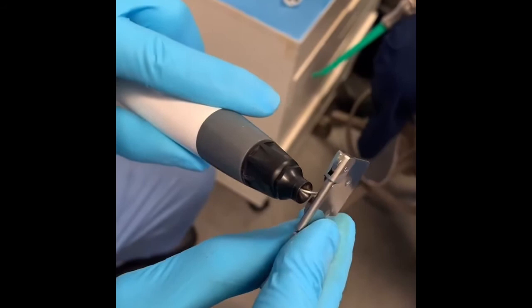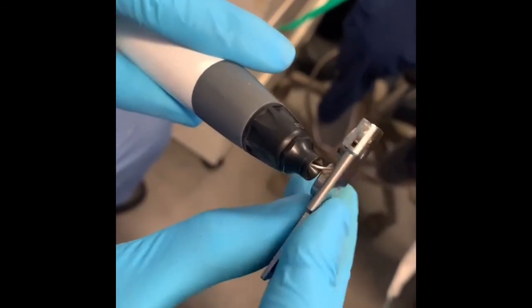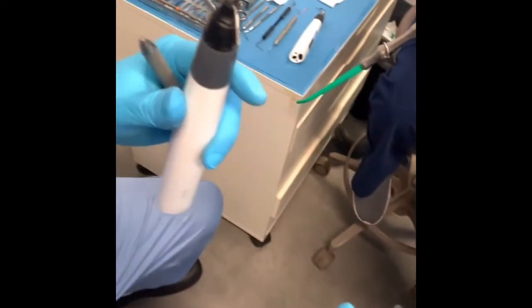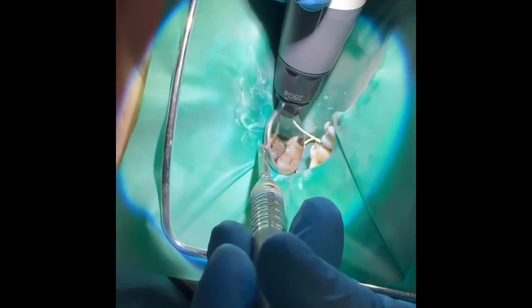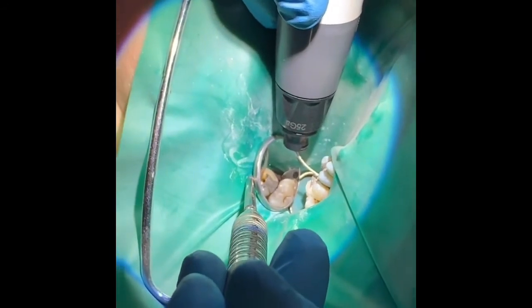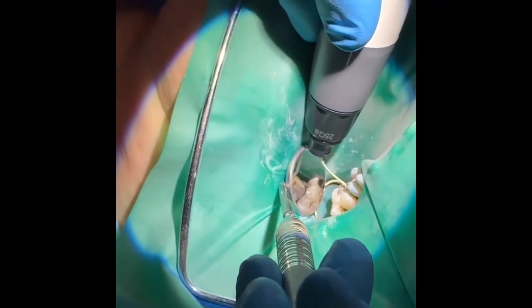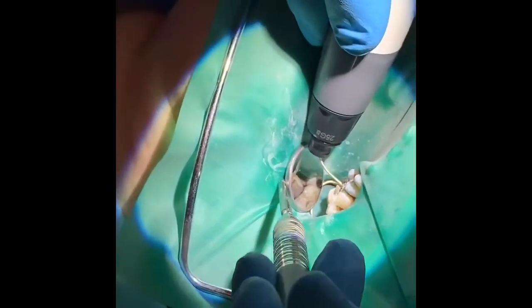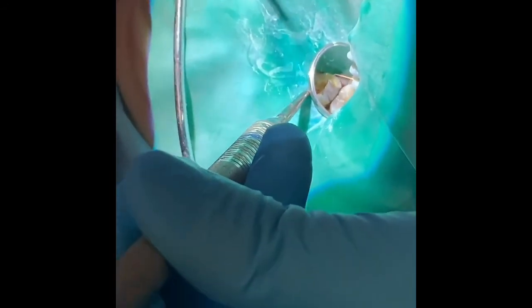Let's bend it, but not break it. There's a button there — you just hold the button down and it extrudes the gutta percha for you into the canal, just like that. I don't know if you can see in my mirror — wipe this for me, hold on, let's clean that.